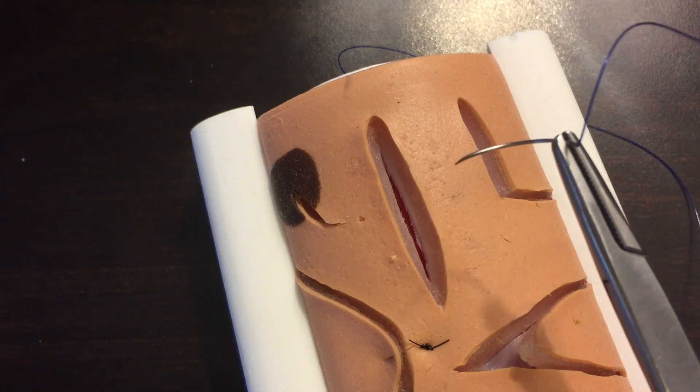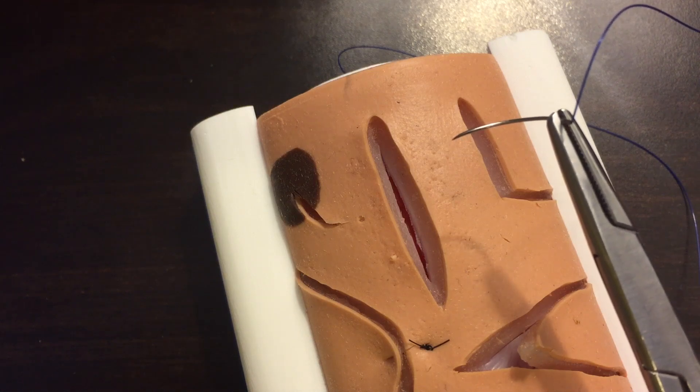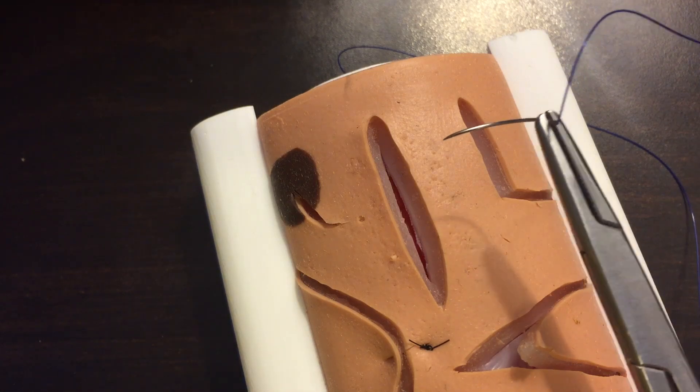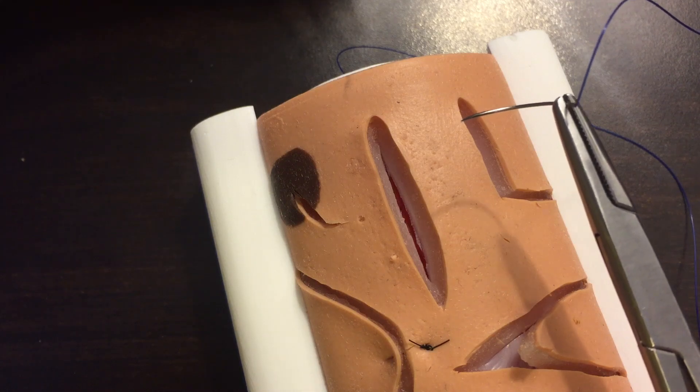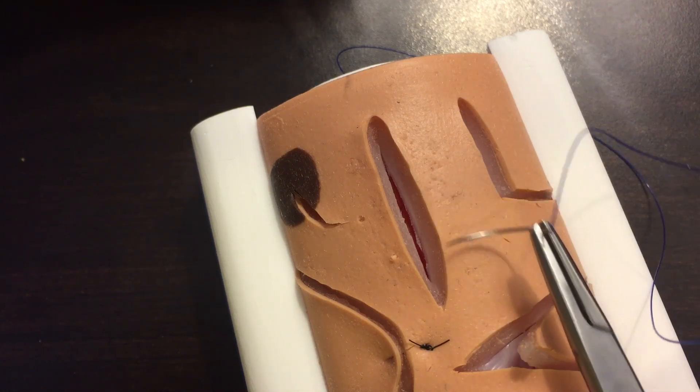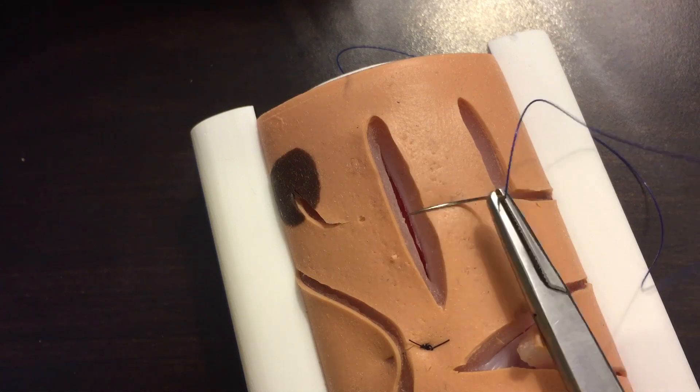Hey everyone, I'd like to demonstrate the horizontal mattress suture. It's very similar to the vertical mattress, however the way you place the suture is in two different planes rather than in one plane across the laceration.